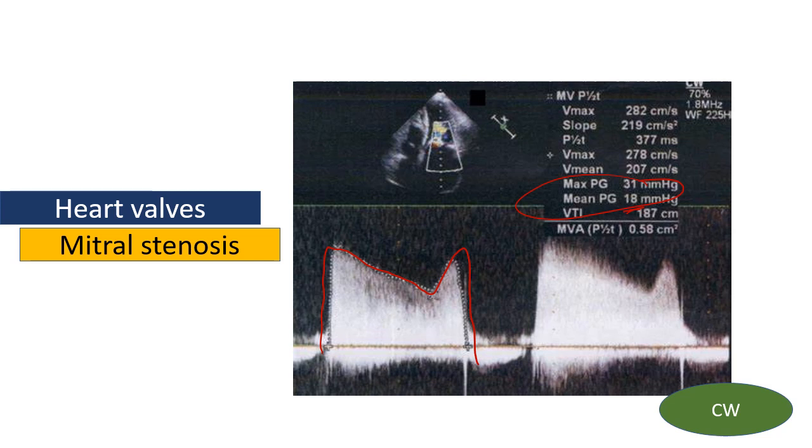And also we can calculate the mitral valve area by obtaining the pressure half-time method. This is one method to obtain the area, and the other more accurate method is to do 2D planimetry by tracing the mitral valve opening in the short axis view. When you get the short axis view and the fish mouth appearance, just trace the opening of the mitral valve and get the calculated area by planimetry.